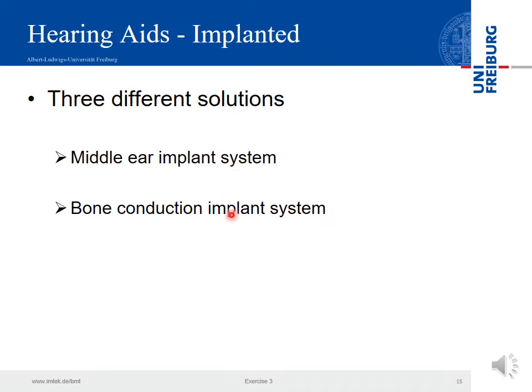We have a so-called bone conduction implant system, with the idea that we do not receive sound only through the ear canal, but also through vibrations.